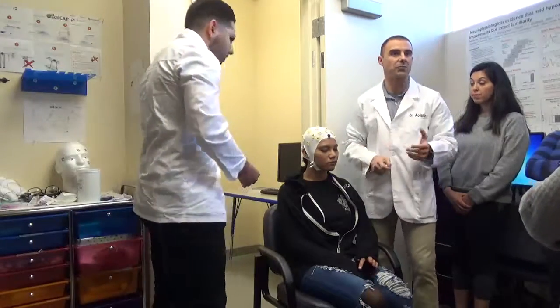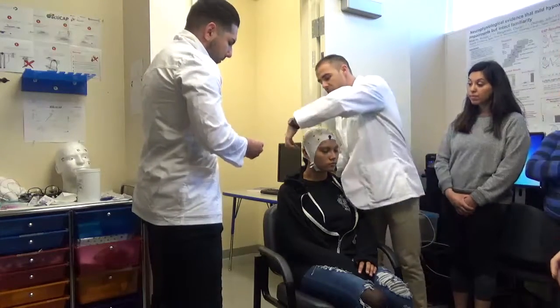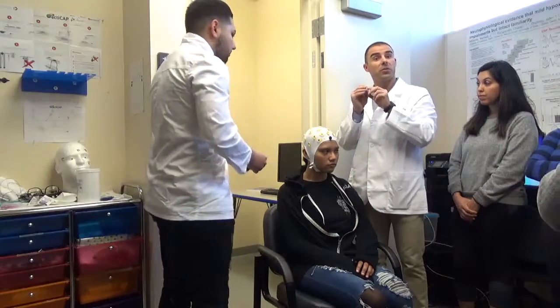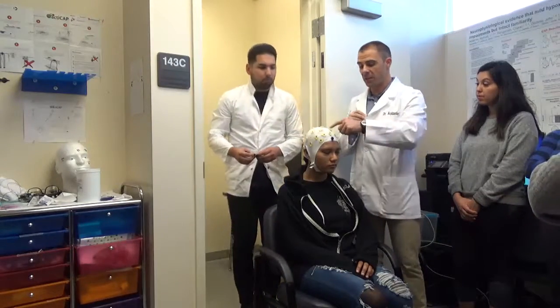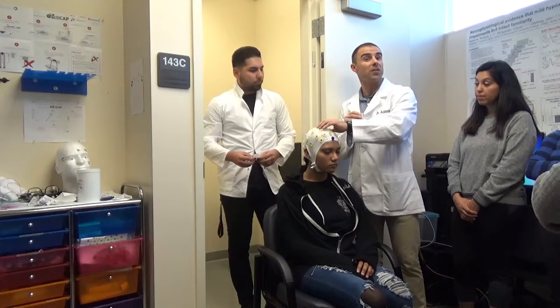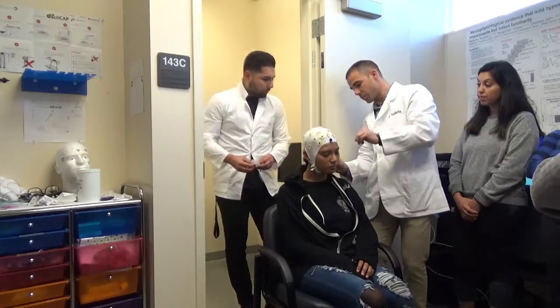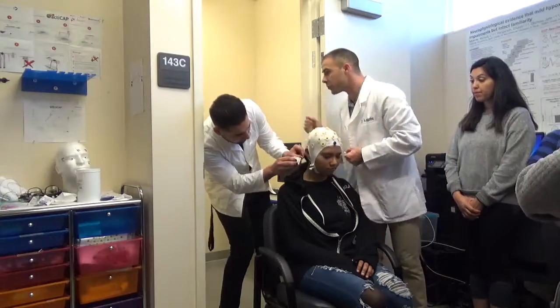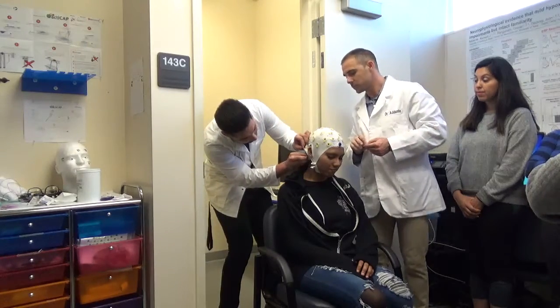Now remember we talked about those mastoid electrodes in class that are really important because we use them as a reference. Okay, these are going to be those two electrodes right behind the ear. So sometimes it's good, if you can reach there, to clean off those sites too, just because that's going to define how good your connection is. Because any other measurements on these sites are only going to be as clean as what we're referring to as a comparison. So you can kind of do that on the mastoid. So there's a little bone back there. So for you, it would be essentially there. Okay. So you want to do it on that. That's it.